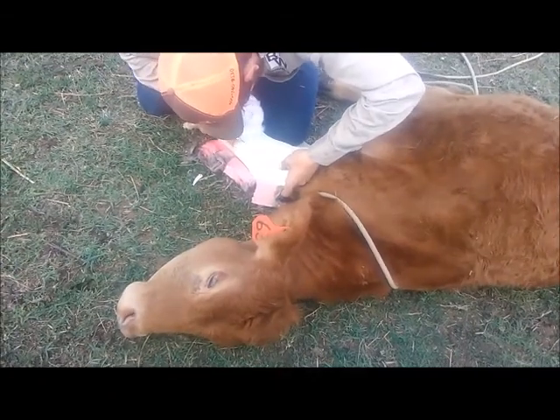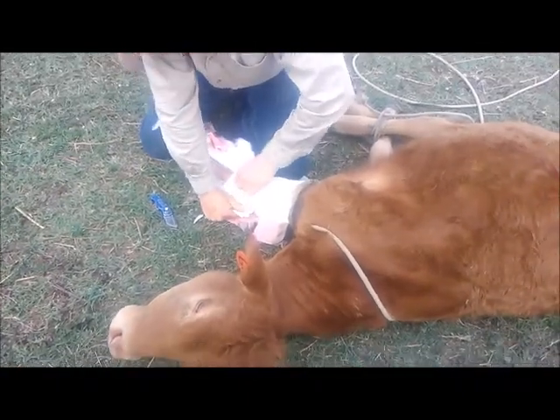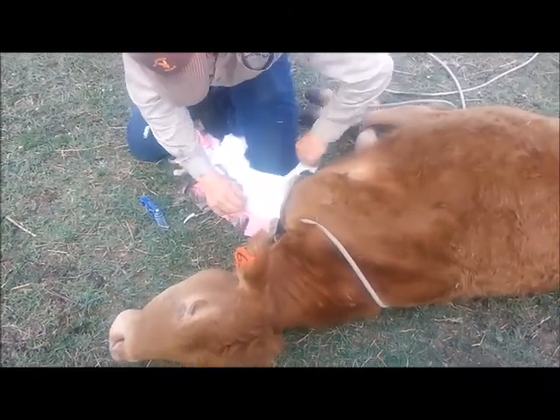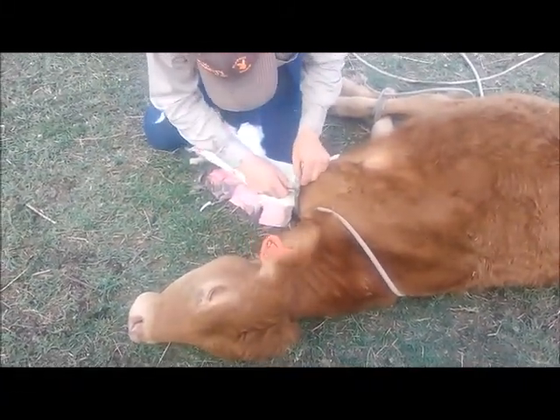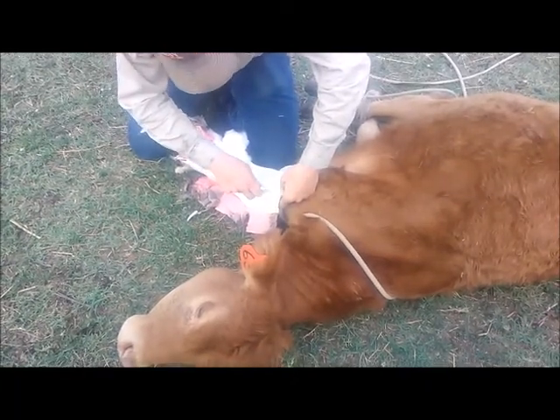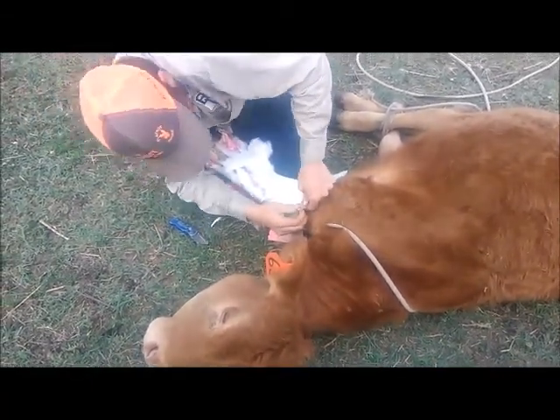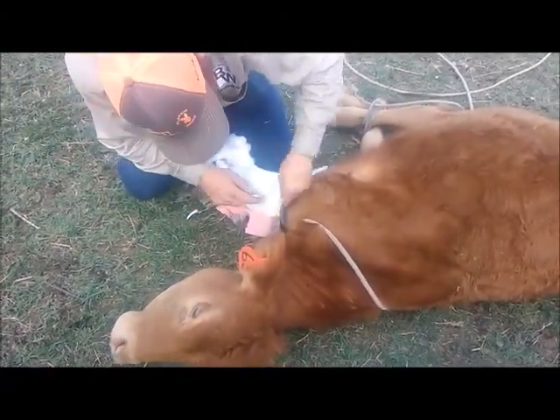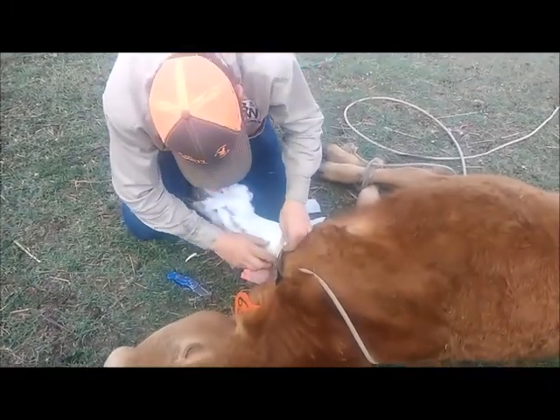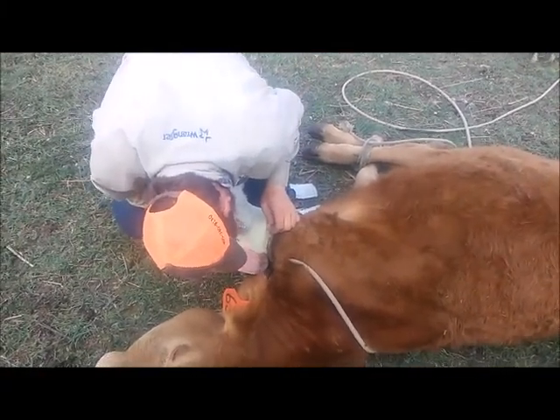Okay, and once it gets through that, then what's underneath — in case that other video didn't work — what's underneath that? Cotton. Okay, and then under that cotton is actually a piece of wood, correct? And that's what you're seeing, not her leg yet. He's got to be careful because that piece of wood doesn't go all the way up her leg, so it's kind of a cut and a rip. He's literally going to take it off probably a layer at a time where there is no board, because it's really hard to get through that cast.